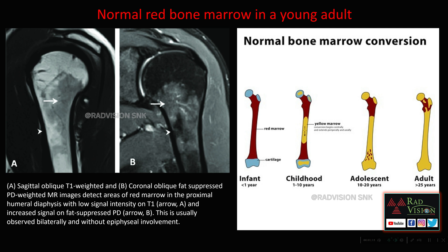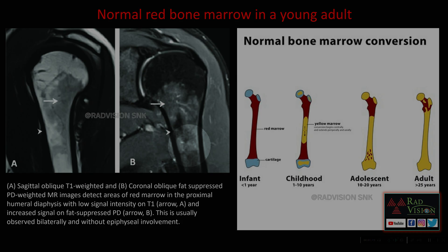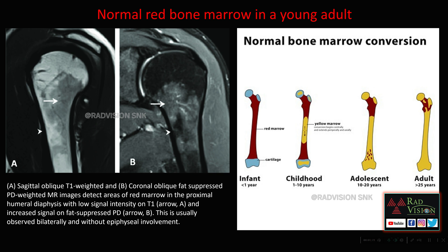Coming to the first one — normal variants — that is normal red bone marrow in an adult. Here you can see this is the normal red marrow in the proximal humerus, which is low signal on T1-weighted images and showing high signal on fat-suppressed PD sequences. This is nothing but normal red marrow in an adult.